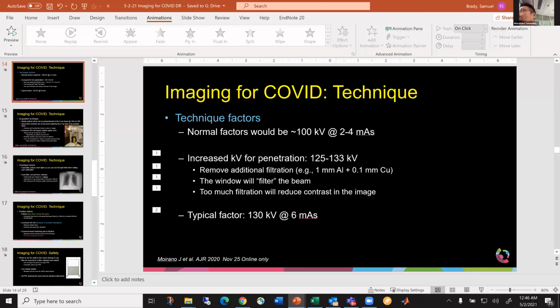But I find that most of the radiographs from the field hospital, the sharpness of the lung markings is not so good. So sometimes we need to repeat many times before making sure that there is lung involvement.